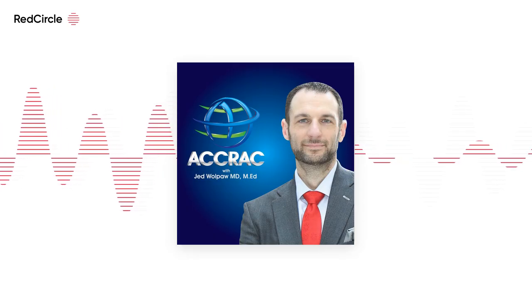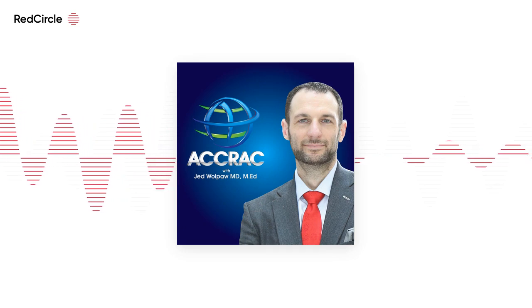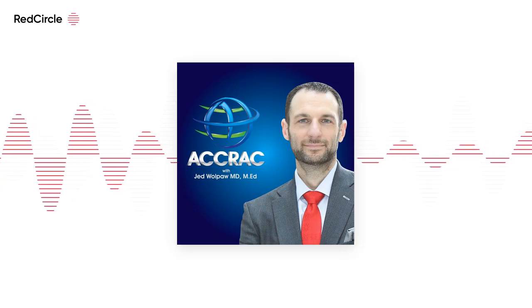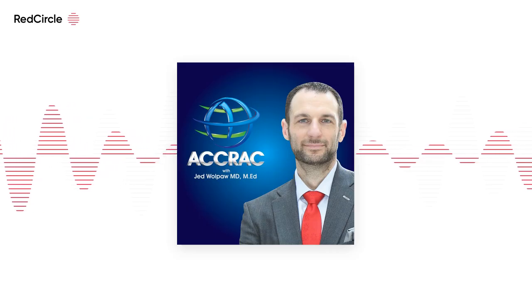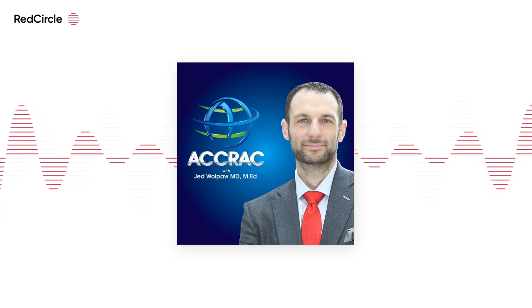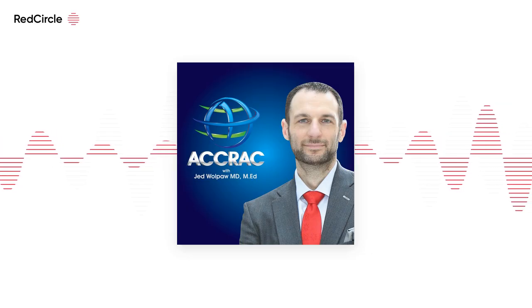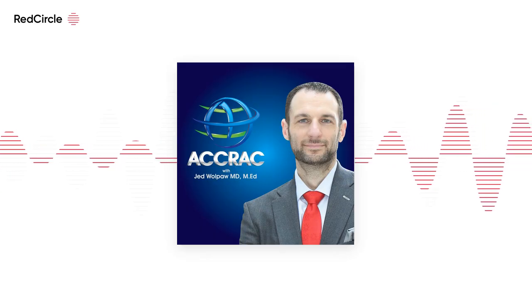But really the easiest way, which every ventilator has, is just using volume assist control settings to read the pressure time curve. You set volume control 300 mLs, PEEP of 5, a rate of 5, you want a very slow rate, and then you adjust either the flow or the I time, whatever your ventilator allows, to give you a flow of 5 liters per minute. As the ventilator delivers that breath, the pressure time curve will increase, and it's either going to be linear or it's going to have an inflection point. If it has a very significant inflection point, you just freeze your waveform, move your cursor over, and that tells you where your airway closure is.